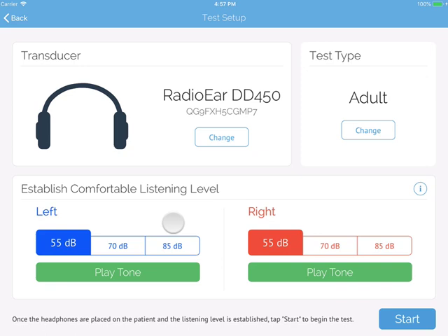Establishing a comfortable listening level is an optional step that you can use for test subjects with known hearing loss. Press the Play Tone button to see if they can hear 55 decibels loud and clear. If not, move up to 70 decibels and so forth. This will give the test subject an idea of how the tones will be presented during their test and will help to ensure that the first tone presented will be one they can hear loud and clear.